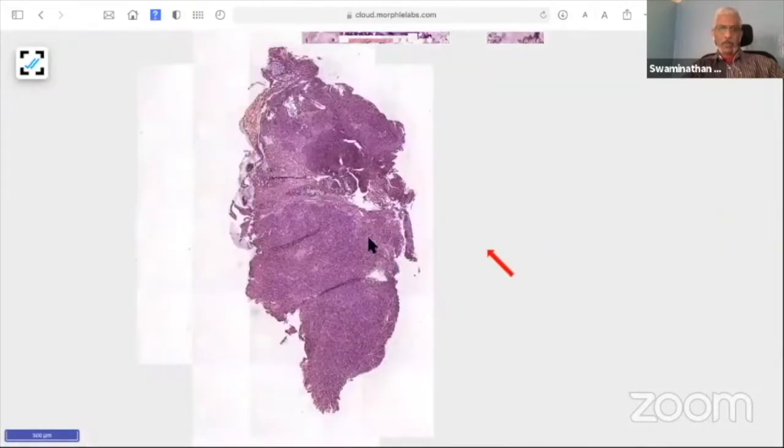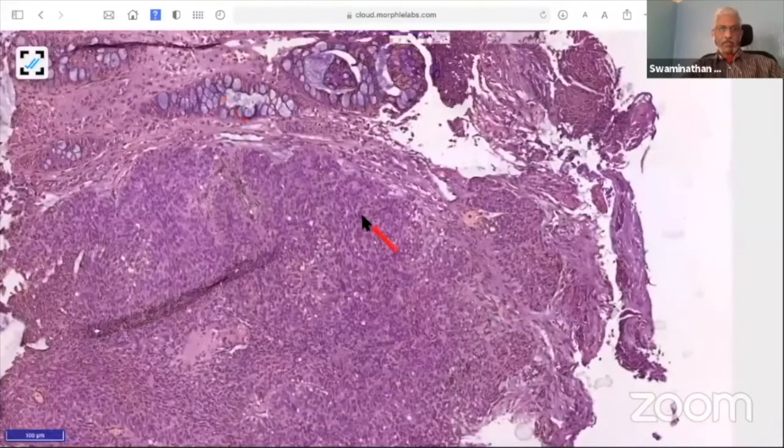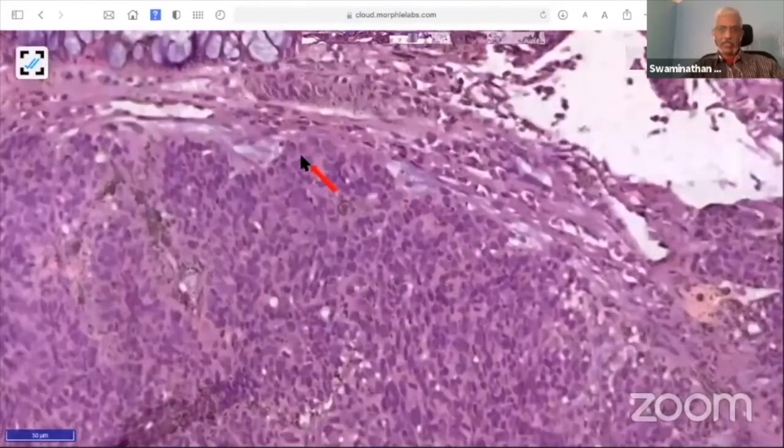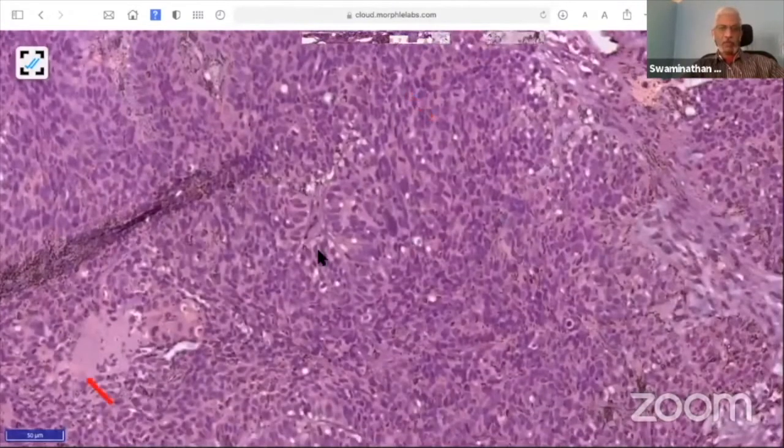Slide 17 from the colon, from a big mass. And it's predominantly tumor. And you can see entrapped epithelium. These are small blue cells. They look basaloid and they show peripheral palisading. Peripheral palisading you can see in high power, nicely seen. And they show some comedonecrosis.